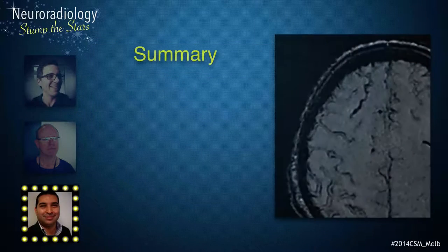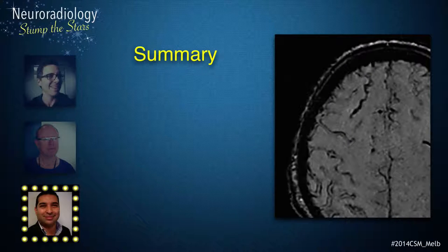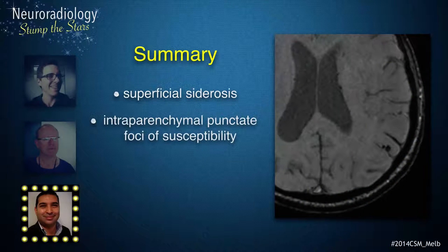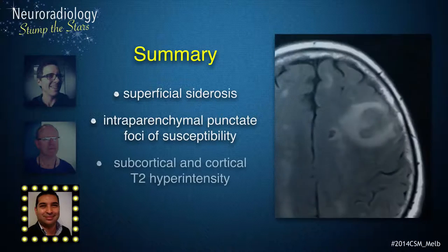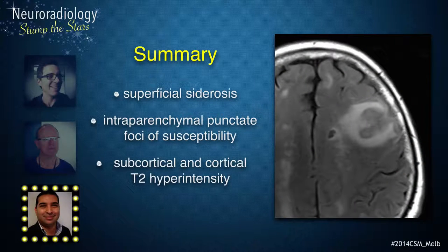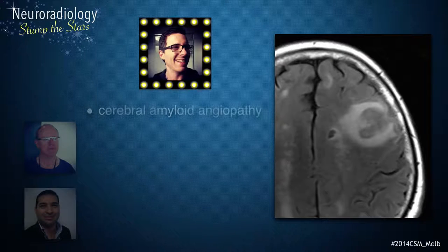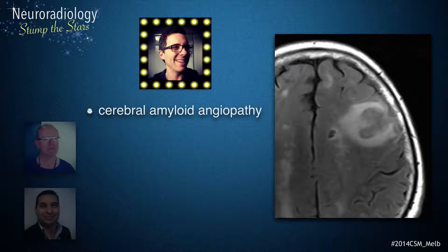In summary, we have extensive superficial siderosis, at least six foci of intraparenchymal susceptibility artifact, and extensive white matter abnormality with some cortical involvement. Overall, the features are characteristic of cerebral amyloid angiopathy, which in isolation fails to account for the relatively circumscribed region of FLAIR signal abnormality in the left frontal lobe with mass effect.